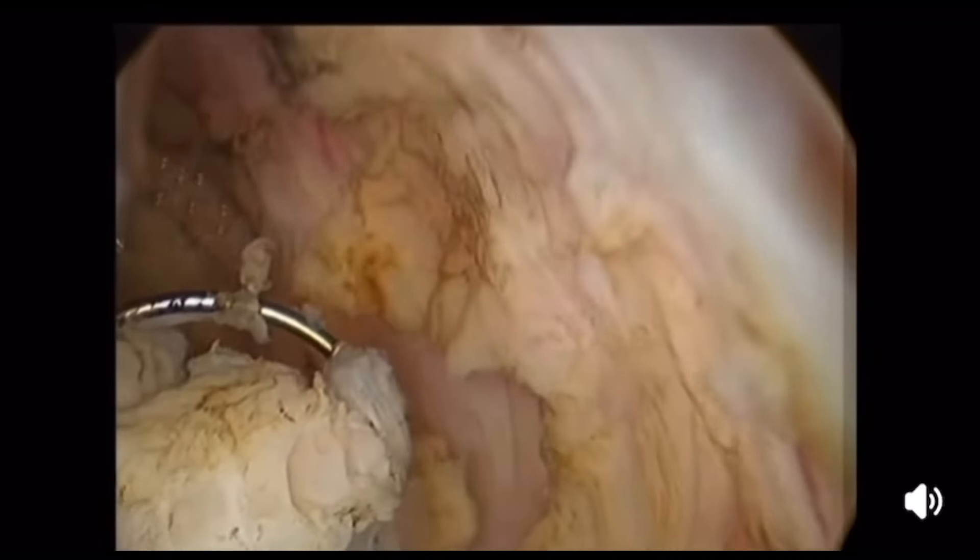Enjoy the video and keep your hands and wrist moving — this will train your neuromuscular coordination. Resectoscopy is an art; it is not just cutting. It is the movement, the rotation, the forward-backward, the inward-backward of the electrode and the whole system. Definitely there are alternative methods like the shavers, which I believe have a big advantage and a place, but they will not replace the resectoscope. There is a place for every technology — don't be short-sighted. More equipment, more values, more training, more skills.